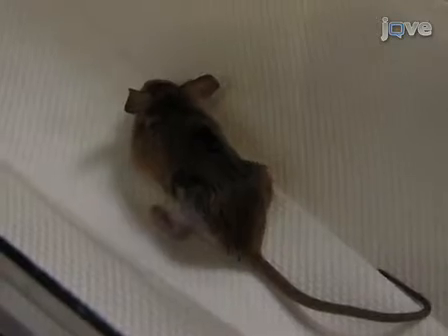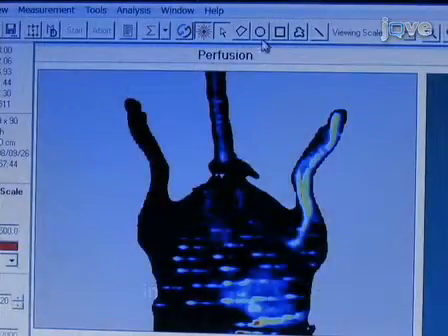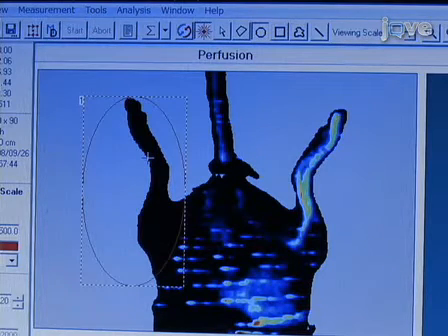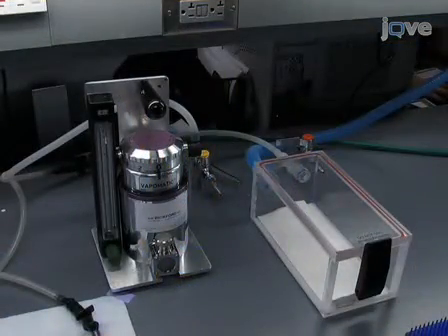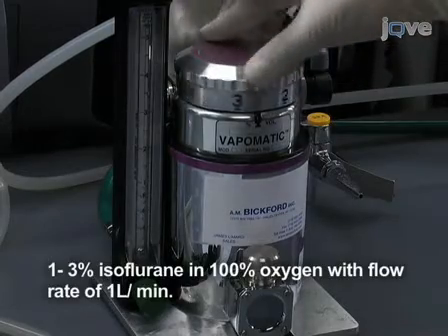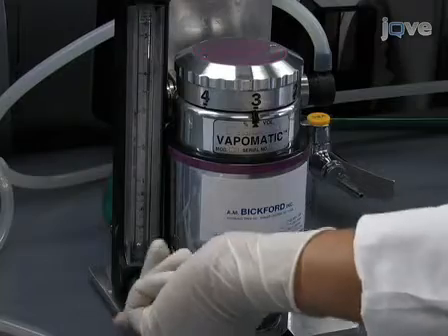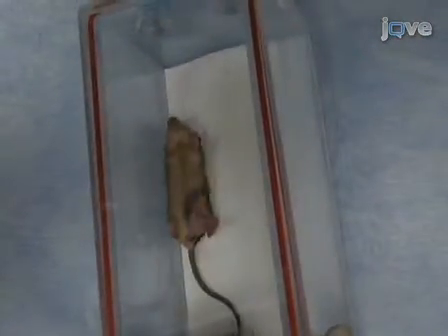Begin the procedure by preparing an 8-month-old SV129 strain mouse that has undergone hind limb ischemia for cell transplantation. To do this, place the mouse into the anesthesia induction chamber containing 1 to 3% isoflurane in 100% oxygen at a flow rate of 1 liter per minute. Leave the mouse in the induction chamber until it is unresponsive to external stimuli. Then remove the animal from the induction chamber.